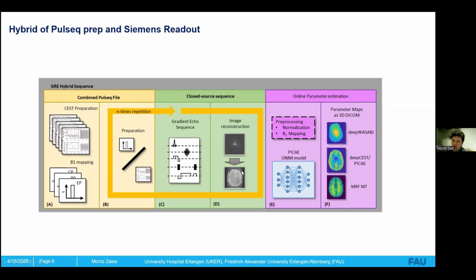So you have the big benefit of having a reconstruction, but you have another big benefit, and this is you can use the latest sequences for readout here, even using deep learning reconstruction as Martin Freudensprung just submitted to MRM this paper today. So there the idea is to combine also more advanced readouts. So that's not the end of it, because now what you have is pre-saturated data, but it would be nice to also have final maps at the scanner.